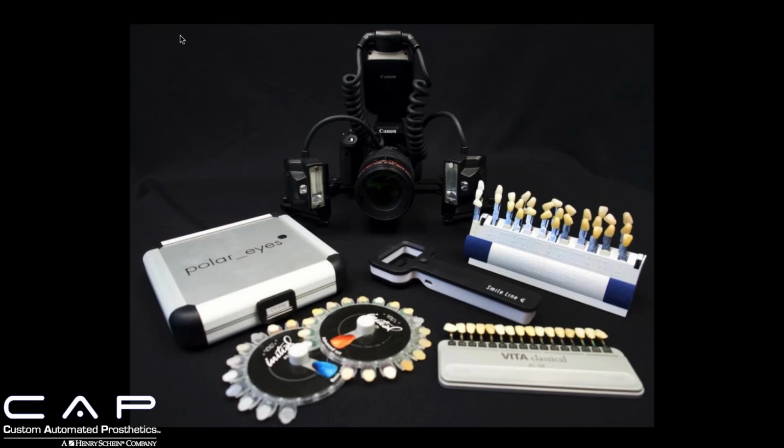It also comes with a polarizing filter to help you correctly choose the shade tab that you think is the closest match. All of these things combined is a pretty basic shade taking armory, I guess you could say, and I've become very reliant on some of these things.